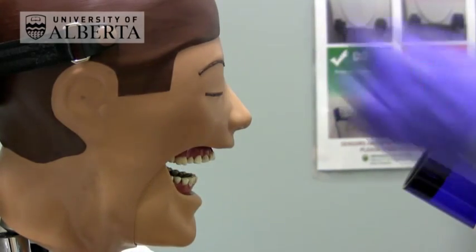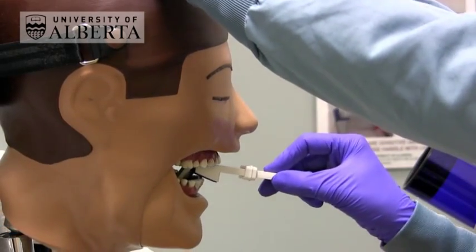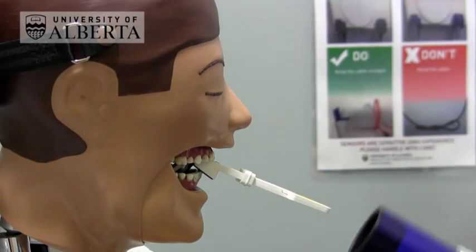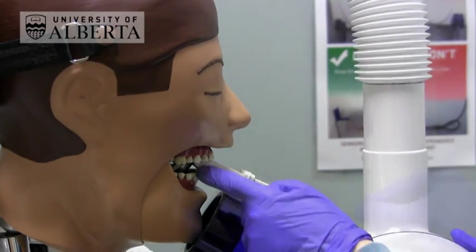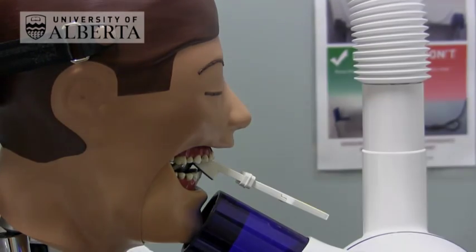For the lower anterior teeth with the bisecting angle technique, position the plate, ask the patient to close together on the bite block, then align the BID as a continuation of the slope of the bite block on the bottom and make the exposure.